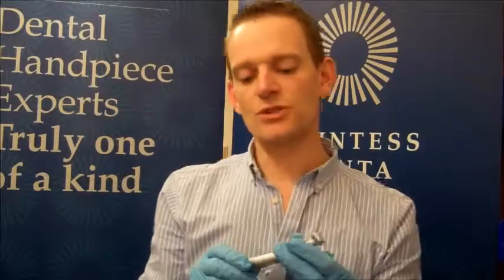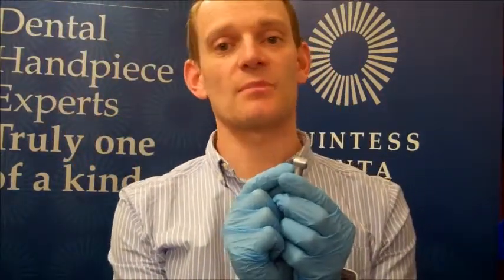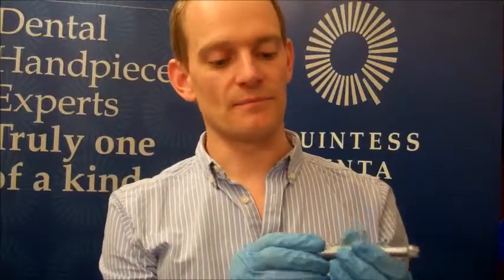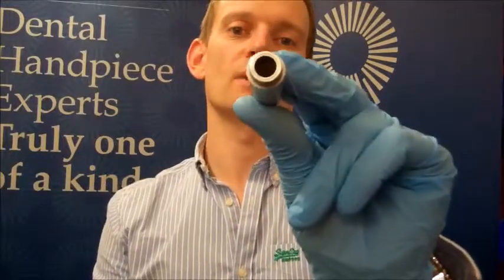Again, clean that down. What you could do then is run the handpiece up just for a couple of seconds to expel any excess oil that's contained within the handpiece. If you do have glass optics, it's just a matter of taking a cotton bud and a little bit of isopropyl alcohol and giving it a little rub to clean the end of it. If you have, you can also clean in around the bottom here, just to clean any dirt or debris out of where the coupling would enter as well.